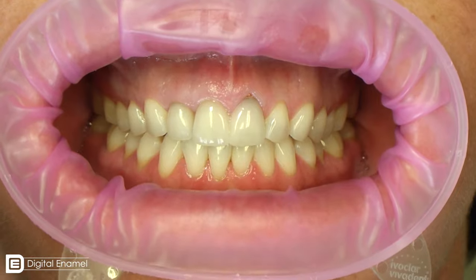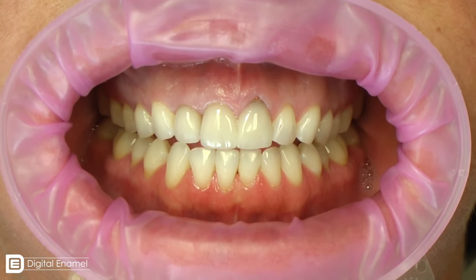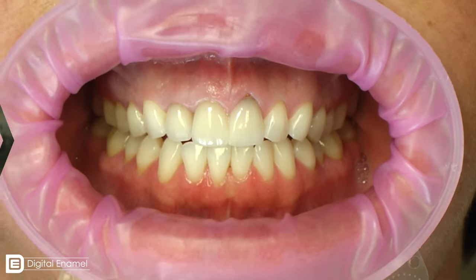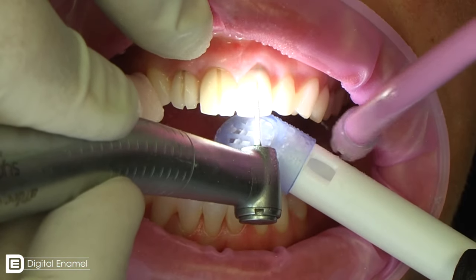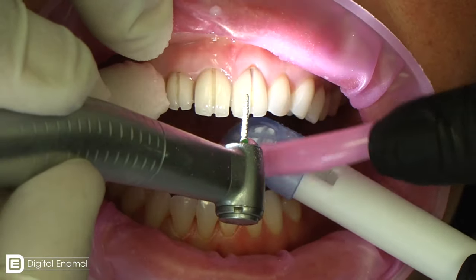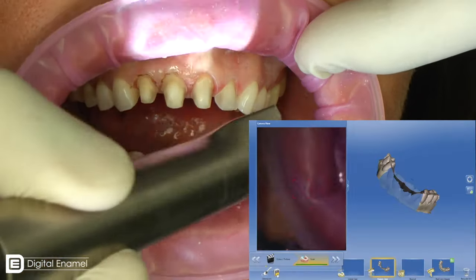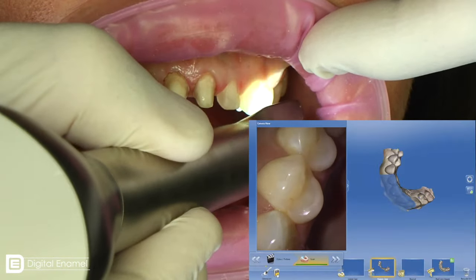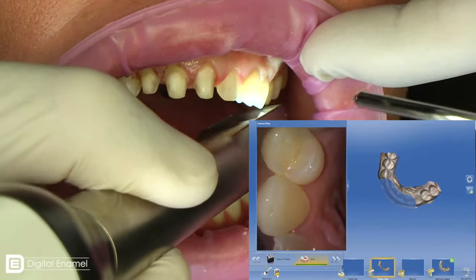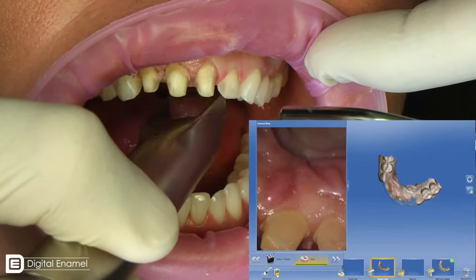We have Lori here. We've got an Optragate from Ivoclar Vivadent, and we always use that because it helps keep things retracted. Taking these three restorations off is not very hard — they're probably a feldspathic ceramic, so we use a typical situation where we make notches. Then we refine the preparations and use a little bit of laser to get the height-to-width ratio or the gingival apices a little bit higher on her 7 and 8.